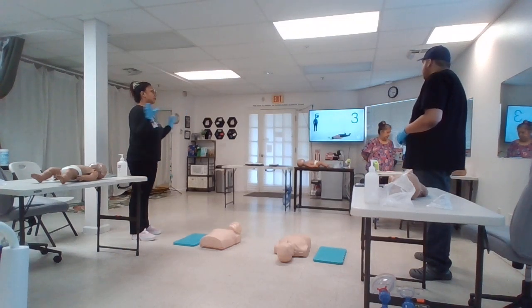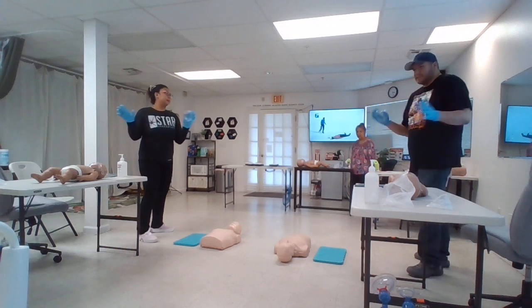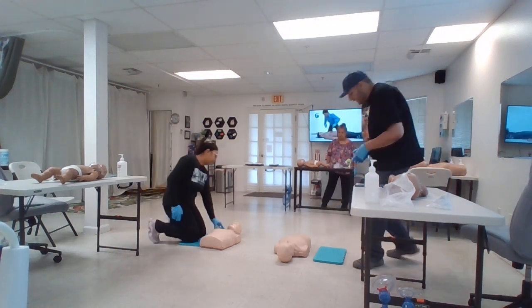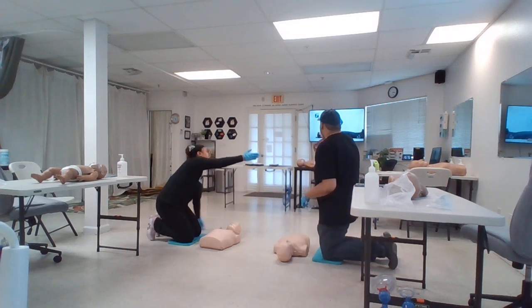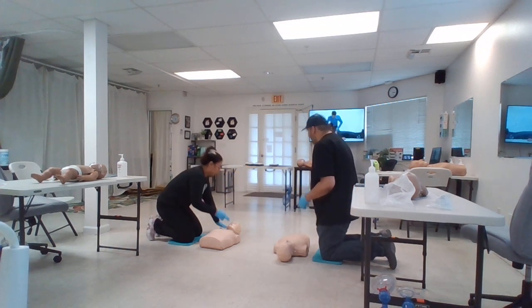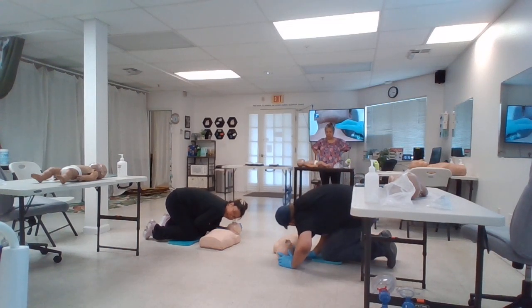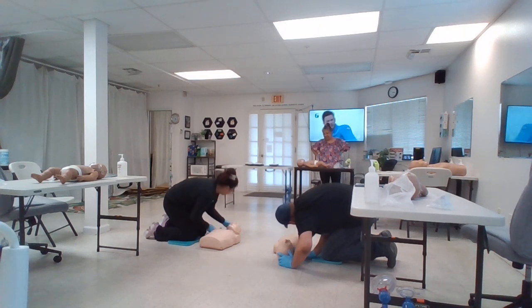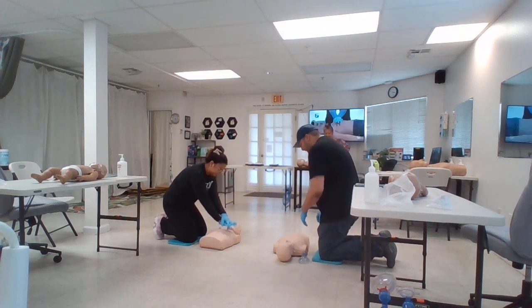Here we go. In 3, 2, 1. Hey, are you alright? Are you okay? Activate the emergency response. Get an AED. Activate the emergency response to get the AED. Alright, checking her breathing.